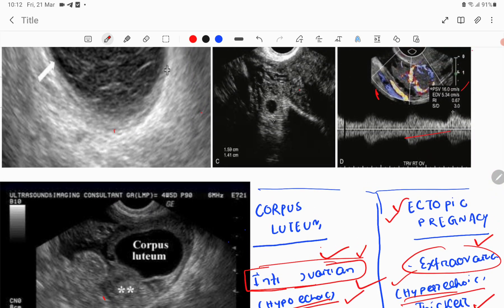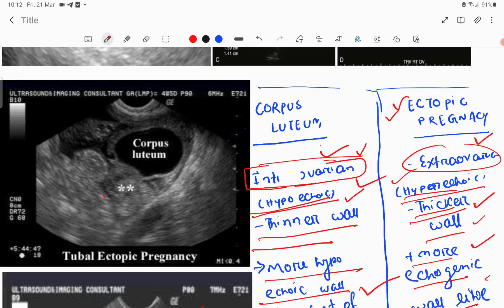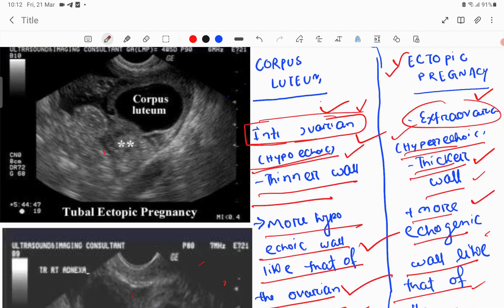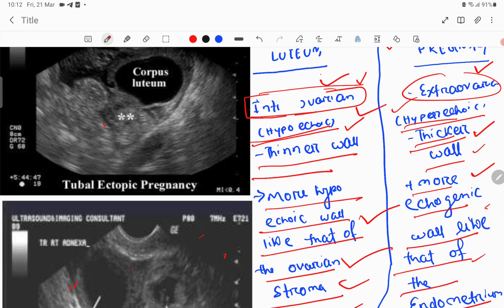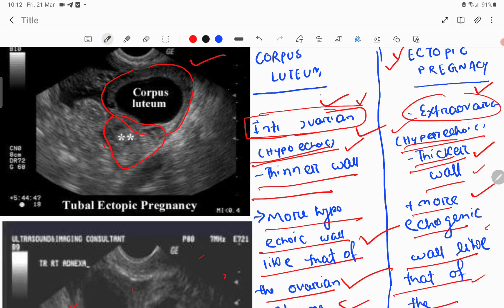The next important feature is wall thickness. In the corpus luteum, the wall is thinner, and because of this thinner wall it is hypoechoic — more hypoechoic. You can see in the images: it has a thinner wall and is very hypoechoic. The corpus luteum is attached to the ovary. Tubal pregnancy is extra-ovarian. A hypoechoic thinner wall indicates corpus luteum.